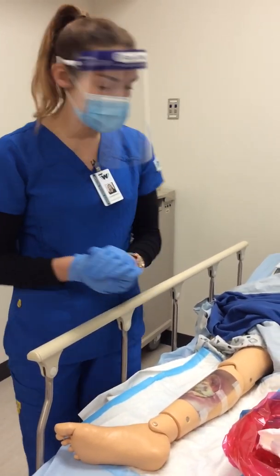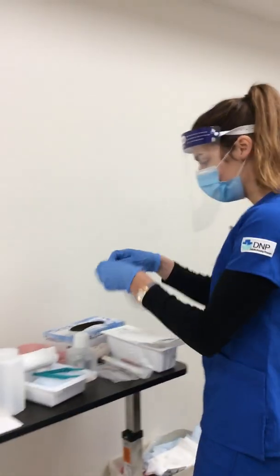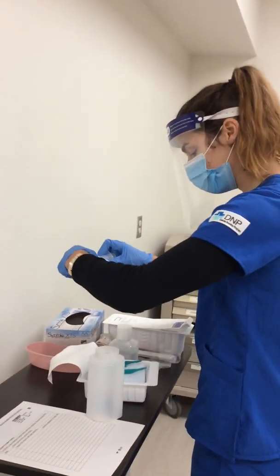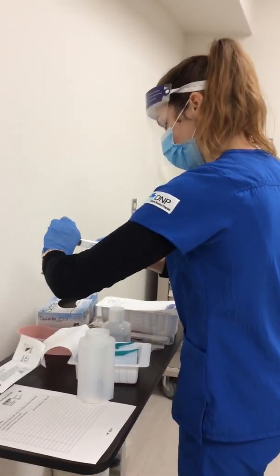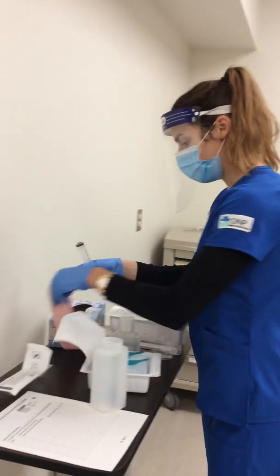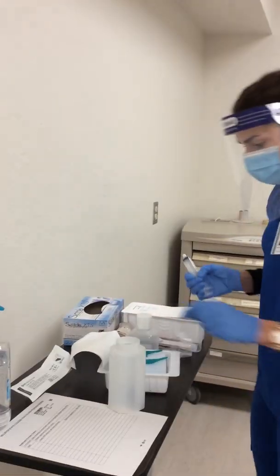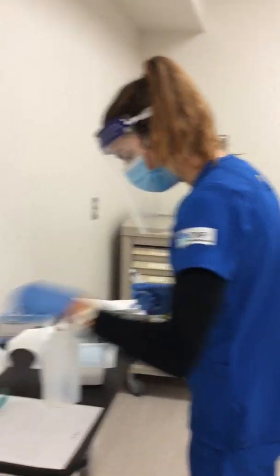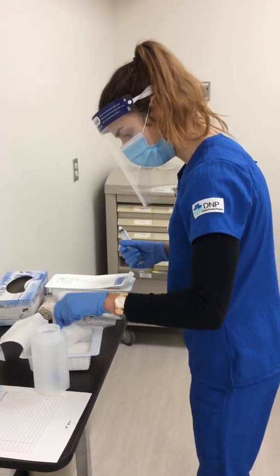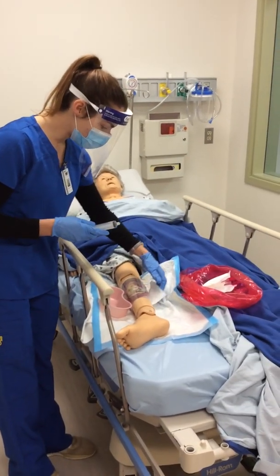Well, we're going to start cleaning it now, so I'm going to get my syringe ready. And we're going to use an AngioCath tip and a 30 milliliter syringe. So we put the tip on, maintaining a sterile tip on the tube. Get my basin, set that there. And then we will also grab some gauze. All right, let me know if you have any pain or discomfort.